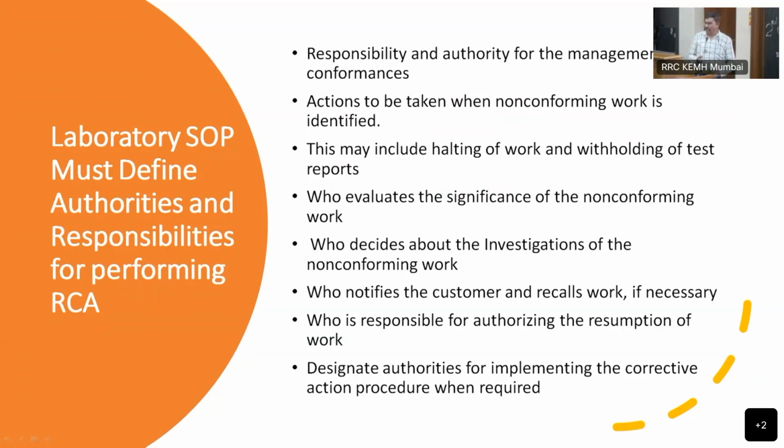अगर कोई wrong report आता है, should withhold it. सब जो मैंने अभी HPLC का design बताया, we should not withhold the batch completely. Other samples are okay, no problem. Okay, they are verified, of course, because controls are out of control limits, out of acceptable limits.